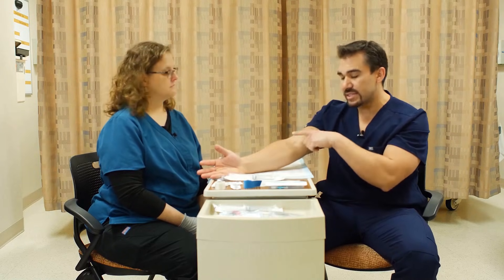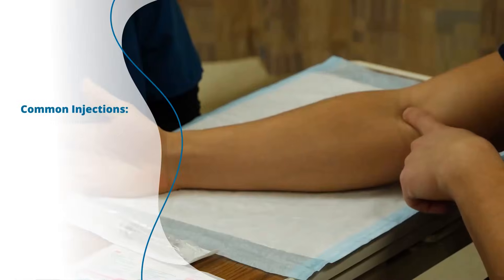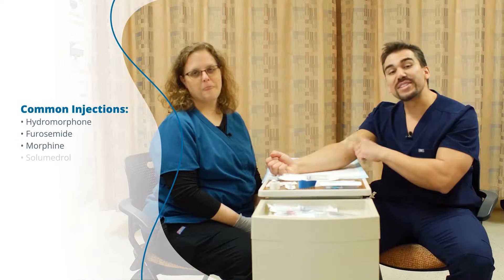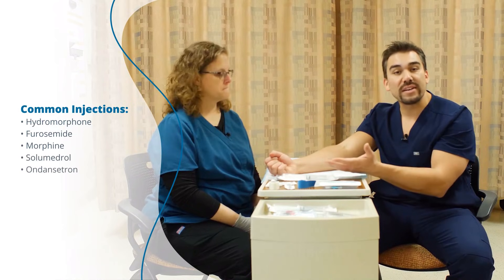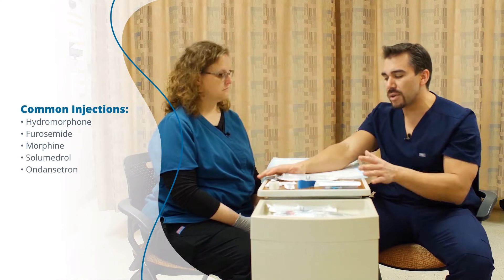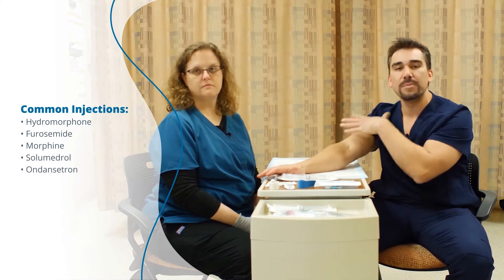Now in the ER, you're going to commonly see it started in the AC, or the antecubital. And you can see why — it's pretty juicy. This is more for blood as well as a lot of fluid volume if we're going to be infusing into the patient. So as a general rule of thumb, we want to start distal and then move up.